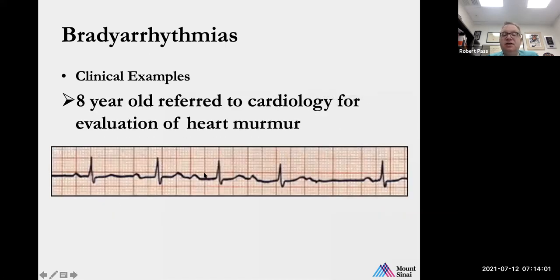And this is an example of Wenckebach block, where the PR interval is lengthening and then a beat is dropped. And again, if we see this on a 24-hour monitor, for example, when a patient is sleeping, not terribly bothered by this, fine. But if somebody has this finding at rest awake, if they're not a very highly trained athlete, this would be an abnormal finding. But again, Mobitz 1 or Wenckebach block is generally due to conduction problems at the level of the AV node, not at the His-Purkinje system.